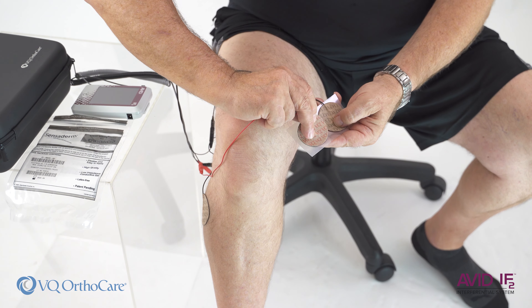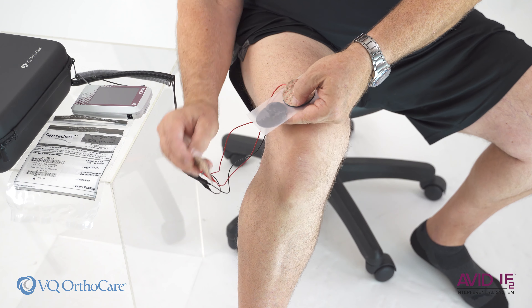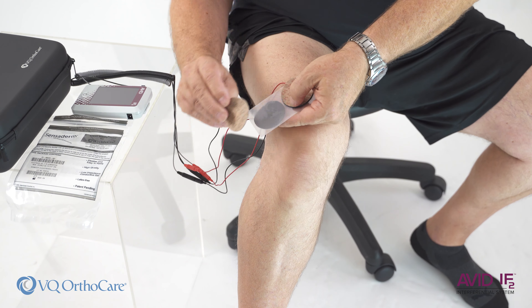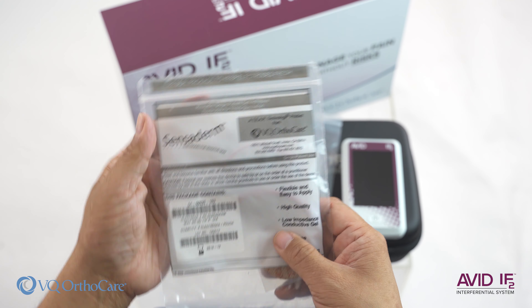At the end of treatment, the device will say 'treatment complete' and may ask you a question about your pain level. Answer the question using the arrows at the bottom and press the check mark. The device will then turn off.